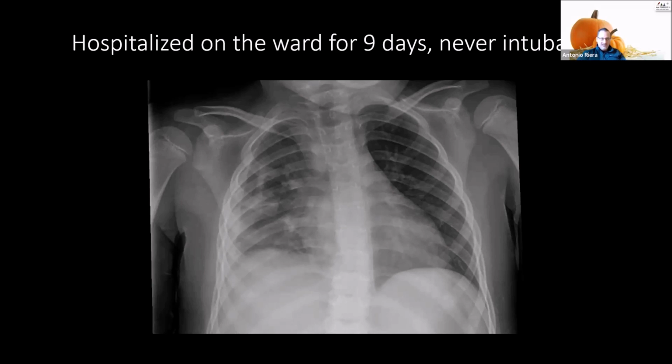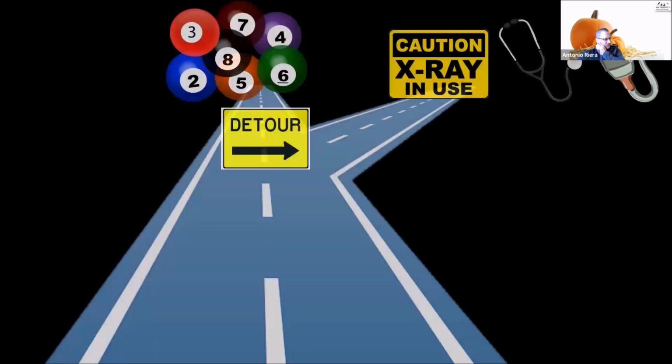And I was just amazed on this case with that ultrasound that this is a child that never required positive pressure. Like just the left side, the oxygenation from the left lung seemed to suffice, and never required BiPAP or high flow or anything like that, with essentially an awful pneumonia on the right side. So I like to start with this case just because kids are so challenging.